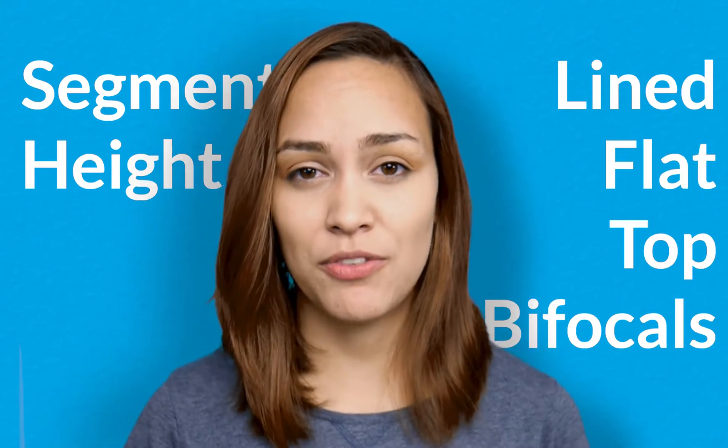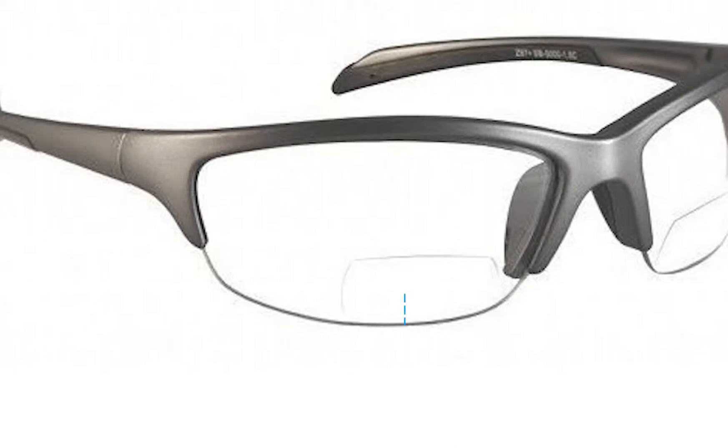In this video I'll be talking about the segment height for lined flat top bifocals. The segment height for this type of lens is the measurement in millimeters from the bottom of the lens to the top line of the lined bifocal.